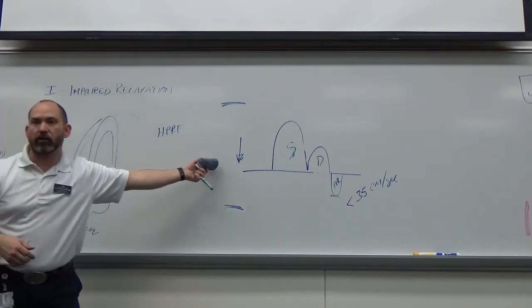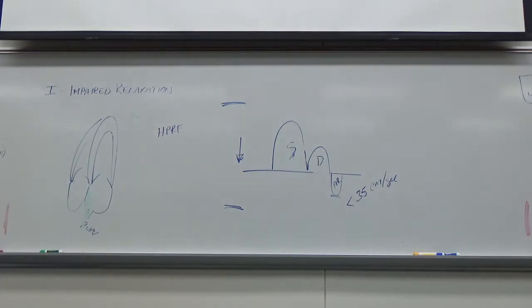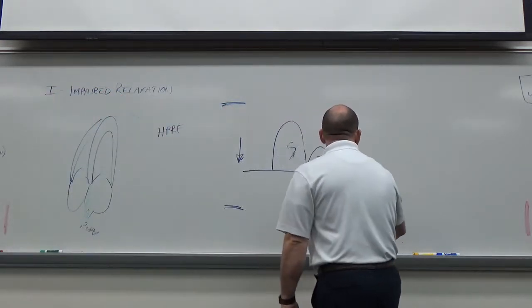Good, so yeah, the scale around this, the upper part is going to be probably around 40 to 60 centimeters per second, but it could vary. I mean, each person's a little bit different, and that's okay. All right, so propagation velocity.